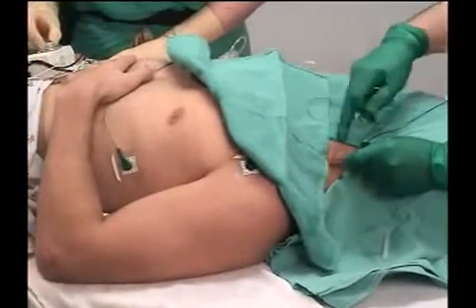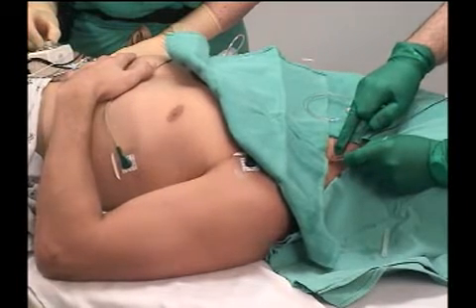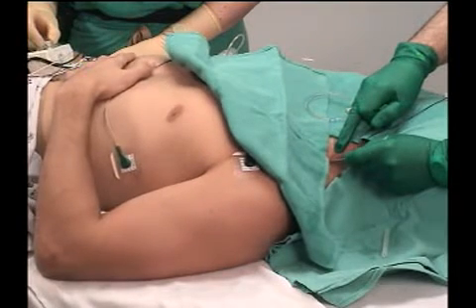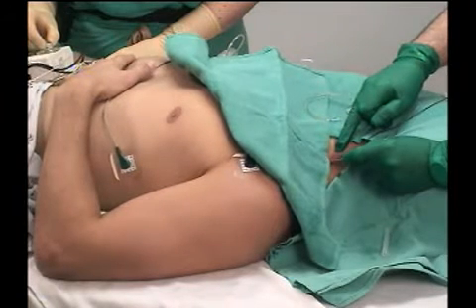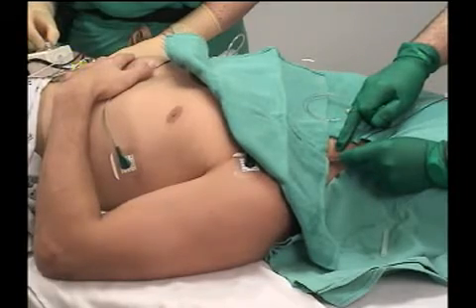Within 1 to 2 centimeters, a contraction of the deltoid, biceps, forearm, and hand is elicited that indicates the stimulation of the anterior trunk of the brachial plexus. The position of the needle is adjusted to maintain the motor response with a current between 0.5 and 0.3 milliamps.